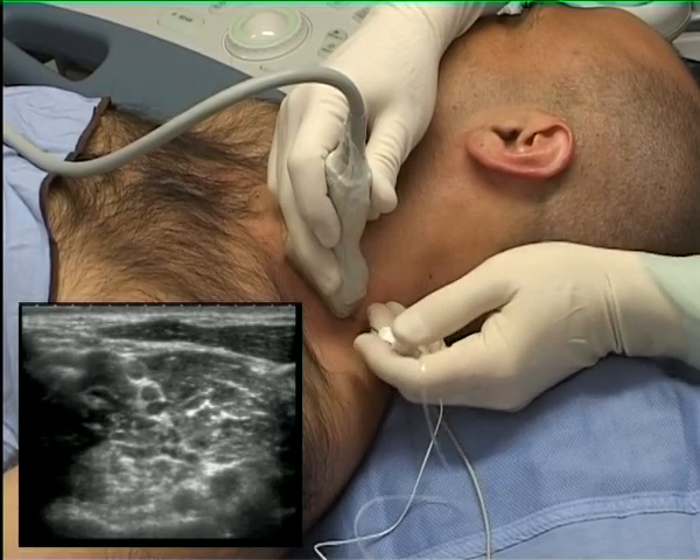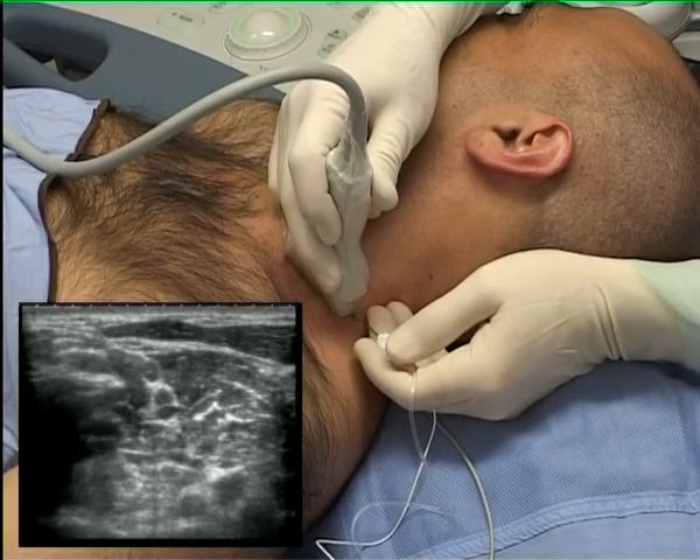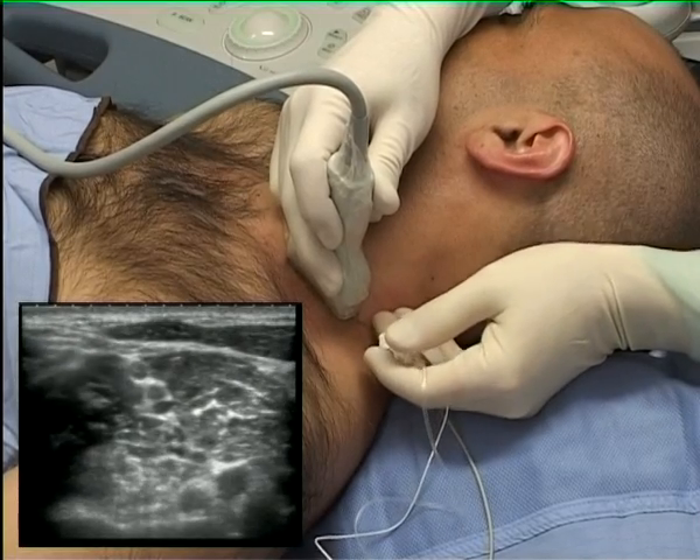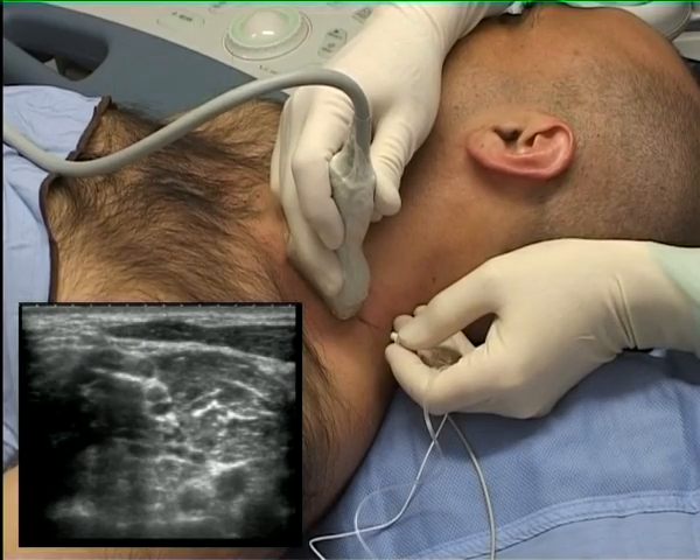In this image, the needle appears from the left side and is seen as a white line. The aim is to place the needle tip between the roots of the brachial plexus.